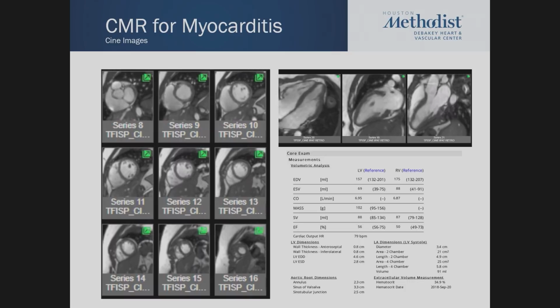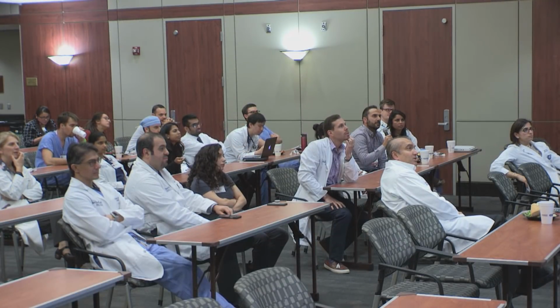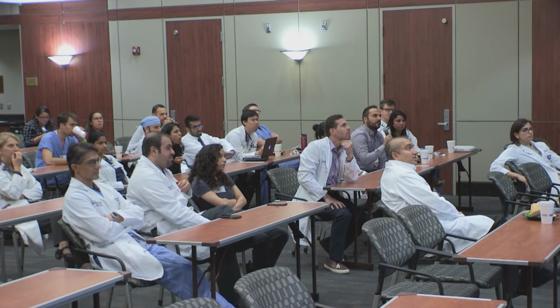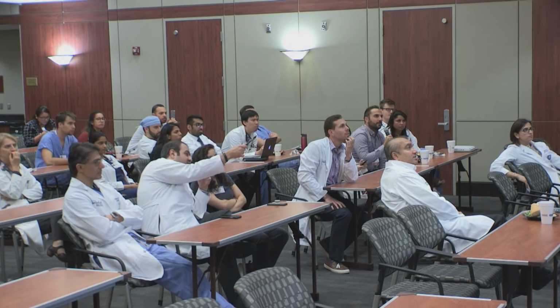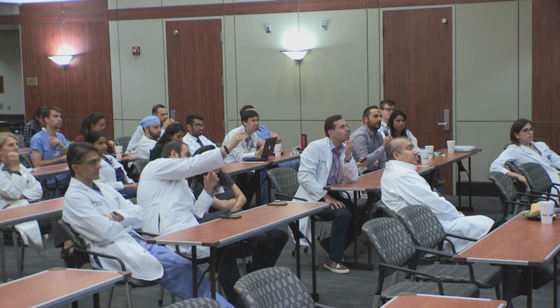And so when you scour through this, you would say you don't see any subtle wall motion abnormalities at all, because again, what you're looking for is not big glaring abnormalities, but small subtle abnormalities. I think there is in the mid anterior septum, if you look at the upper panel on the right, what I noticed at the mid septum, there is a small segment that's not thickening as much as the base or the apex of the septum.